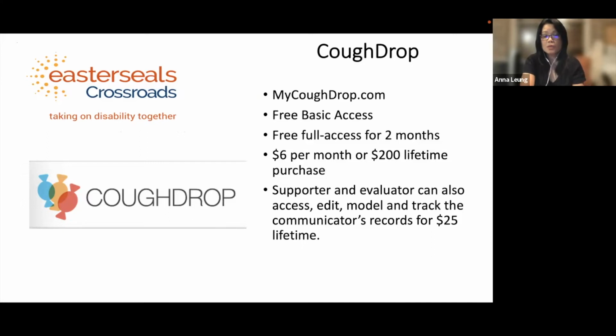Some people who need help with speech use this app together with a supporter or an evaluator. You can also pay $25 to let someone access the app as an evaluator or a supporter.